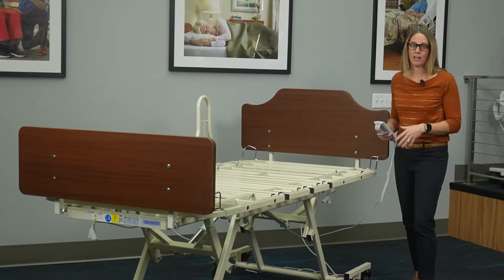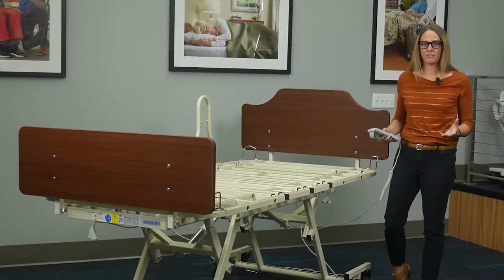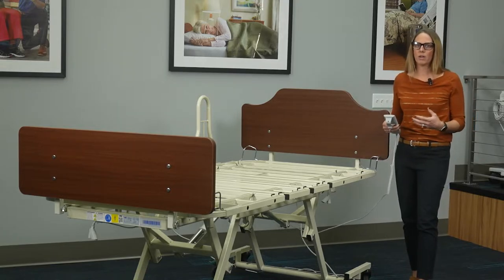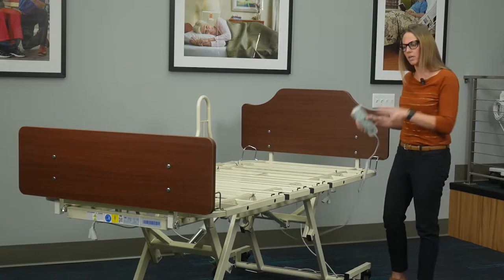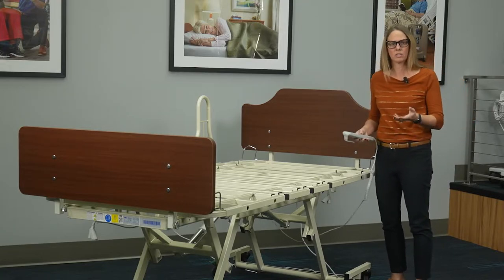The 30-inch high height is really important from a staff safety perspective. When they're turning and repositioning residents or changing linens, we don't want them bent over to do that, so getting to a nice countertop working height is going to keep them safe.